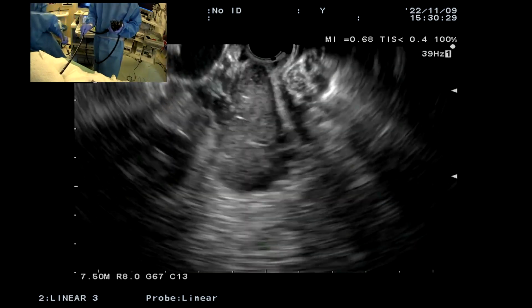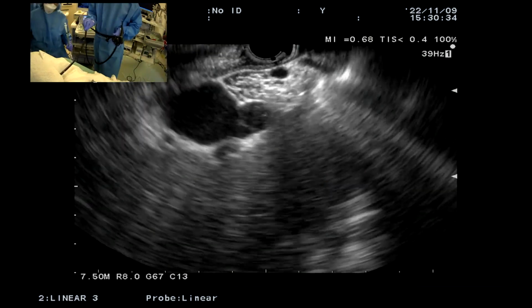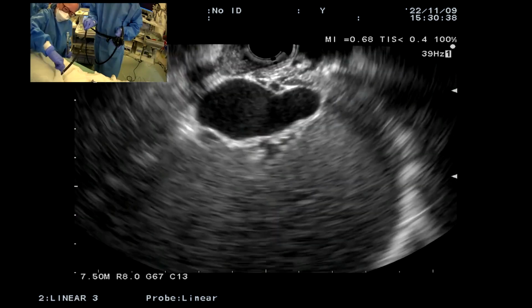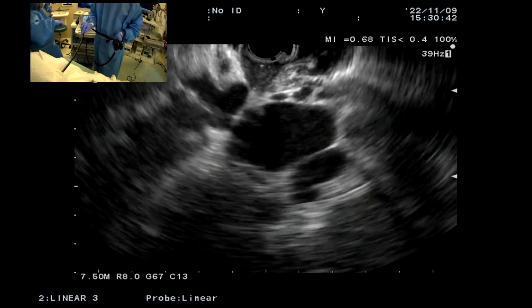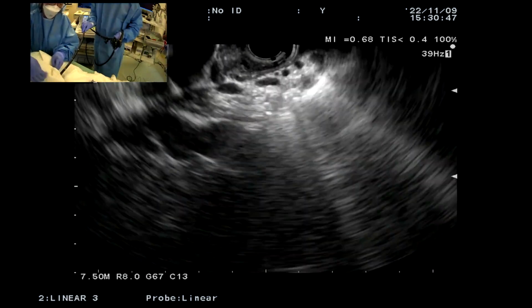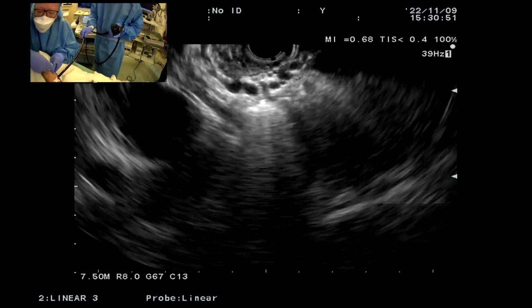So this is the Crus muscle here. That's the angle of His. And below the Crus muscle there is a collateral outside the Crus muscle. So we're, of course, not going to go here. I'm just going to pull it back into the esophagus. You can see some collaterals around the esophagus. We know she has esophageal varices as well.